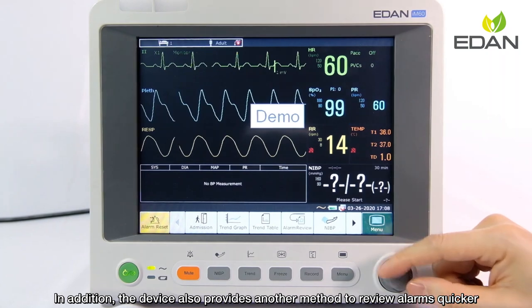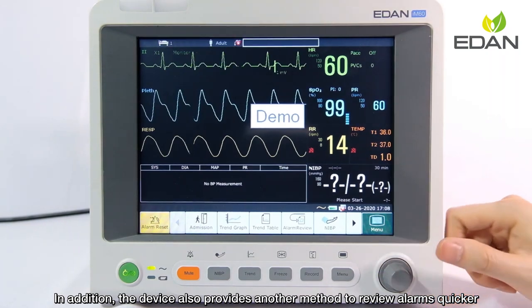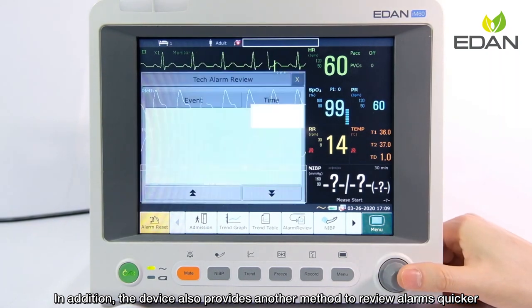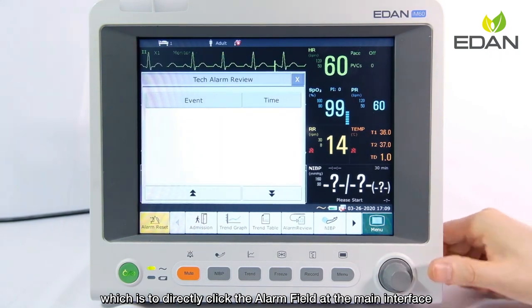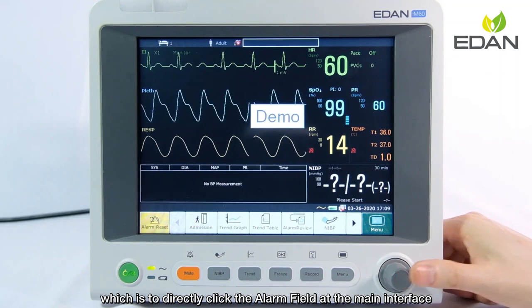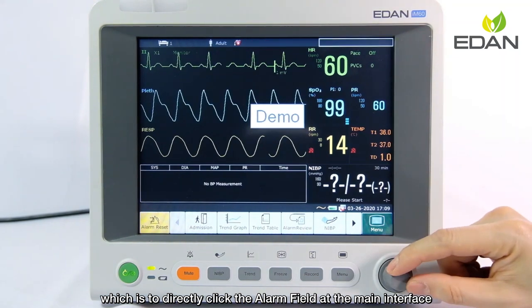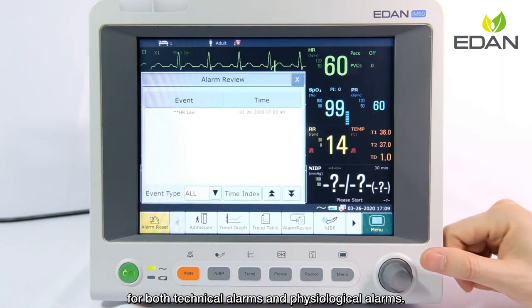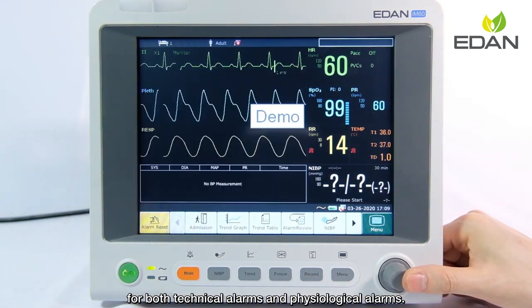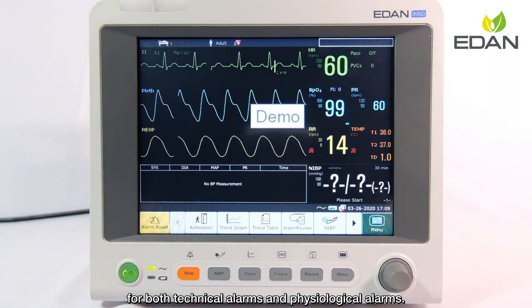In addition, the device also provides another method to review alarms more quickly, which is to directly click the alarm field at the main interface, for both technical alarms and physiological alarms.